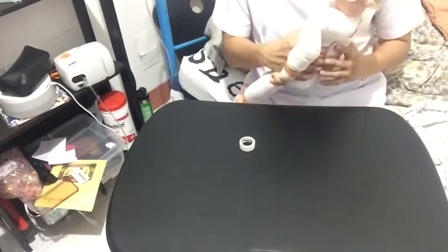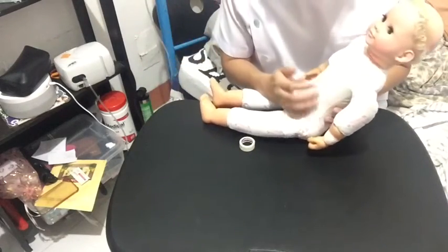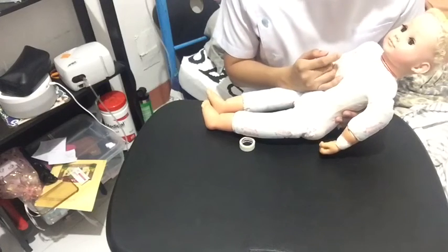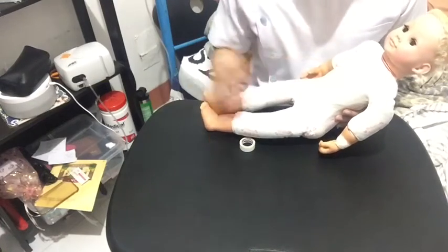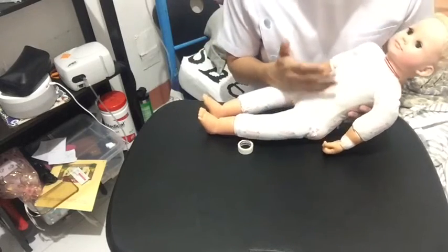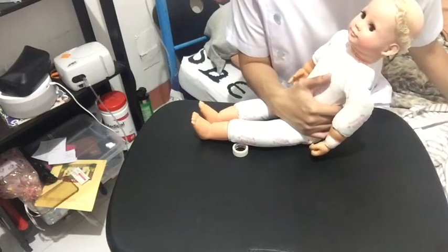During the nebulization phase, we're going to be assessing as well the client's heart rate, the respiratory rate, as well as the pulse oximeter. And we're going to be comparing it from when we started and how it was going.